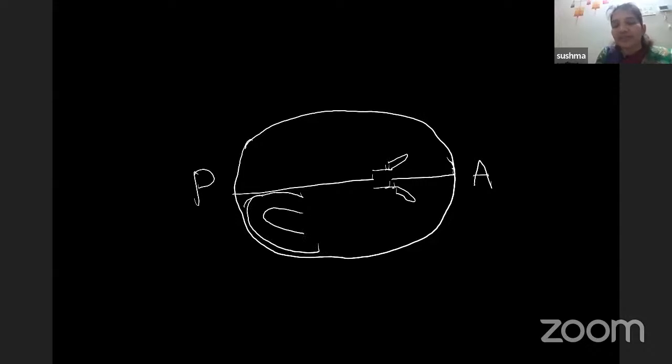Within it, we can see posterior horns of the lateral ventricles. And here the choroid plexus, which is a brightly echogenic structure, is seen. So this picture should be imprinted in the brain, and as and when you see it, you should be able to differentiate the normal transventricular plane from an abnormal transventricular plane as and when you see anything abnormal in this.